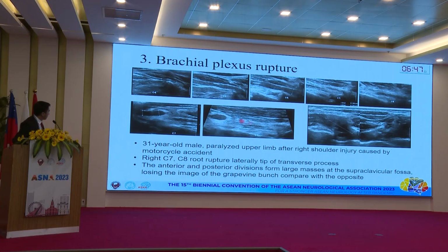The C7, yes, and it also marks a mass in the clavicular fossa. Upper clavicular fossa here, compared to the other side, it's normal, like the graph right here.